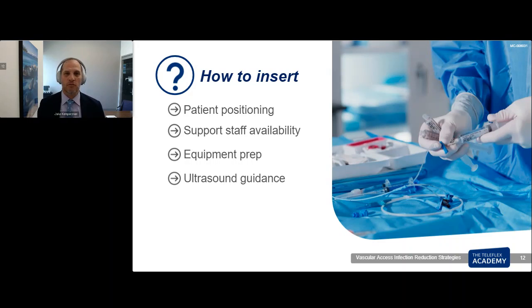Most of the procedures that are performed in the out-of-hospital setting, ED, OR, ICU, are not that terribly difficult. Yes, we've gone through a ton of training. We do them a lot, so we can do them. But what makes them much easier is if we spend the appropriate time positioning the patient, making sure that lines and tubes aren't in the way, making sure that we're moving the telemetry cords, monitoring wires, making sure we have our equipment readily accessible, making sure that your ultrasound machine is in front of you where you can see it.